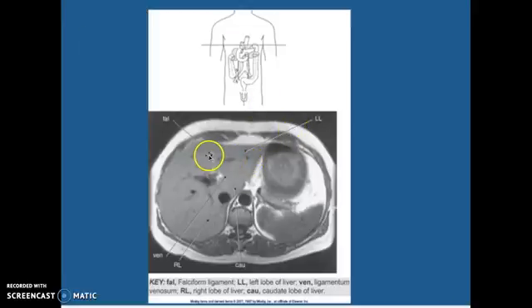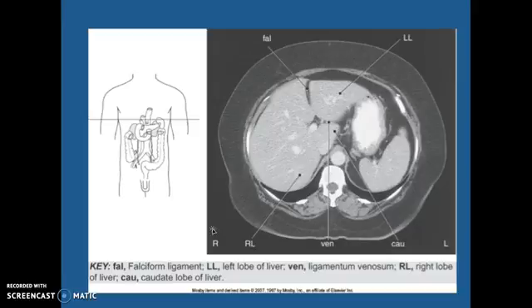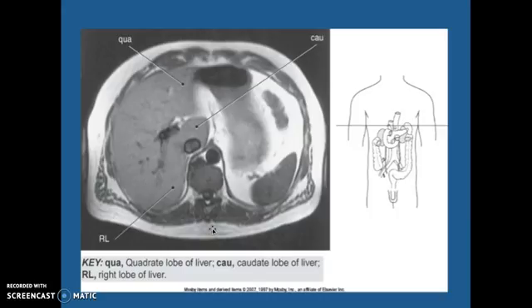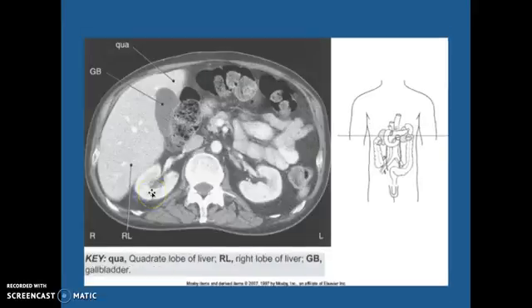Left lobe, falciform ligament. Here's your caudate lobe right there, and this is your right lobe of your liver. A little bit different of a slice compared to the others. Here's your caudate lobe, your quadrate lobe, and your right lobe. Quadrate lobe here. Here's your gallbladder and your right lobe.